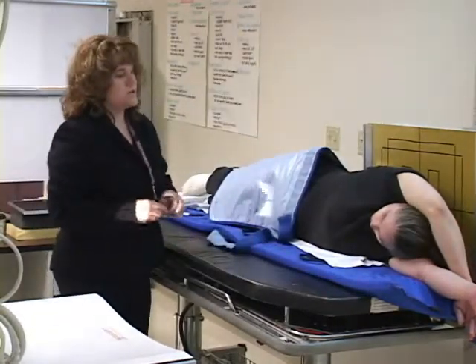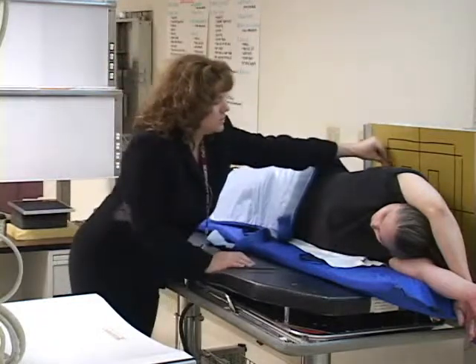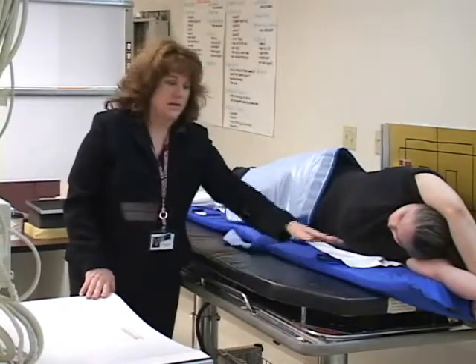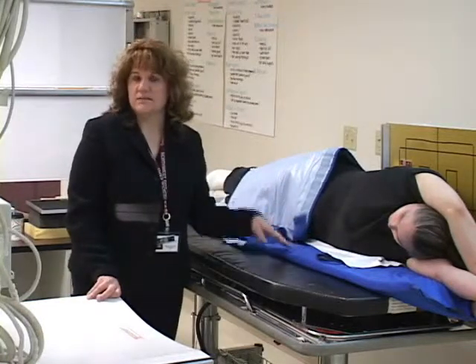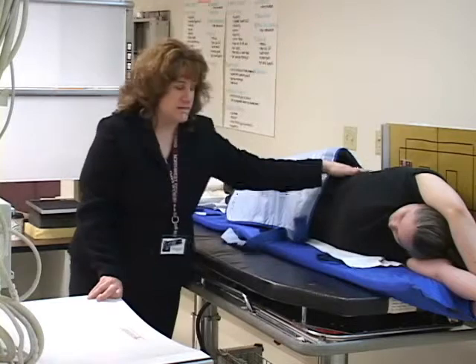My marker is going to go on the body side. So this is her right side. So the marker will go right up in here. Right marker, right side. I'm most interested in, however, the bottom side. So this is an exam that's specifically looking at the left side. This would be considered a left lateral decubitus, and so that's why my right marker is up here, because I'm just marking my body side.